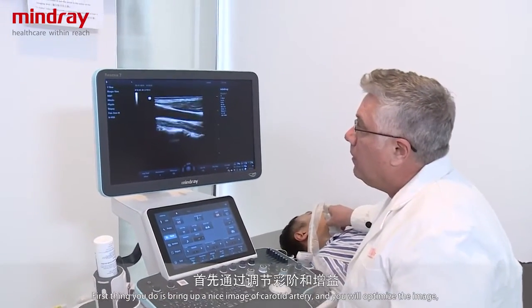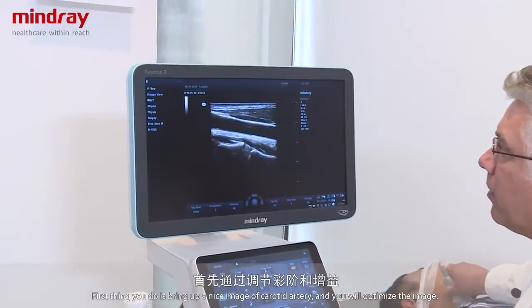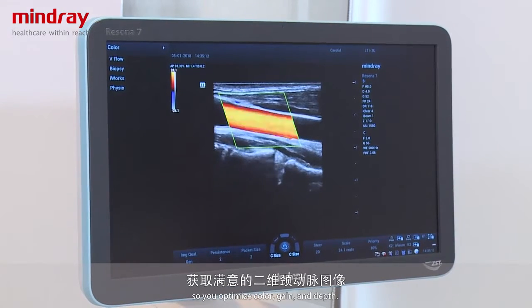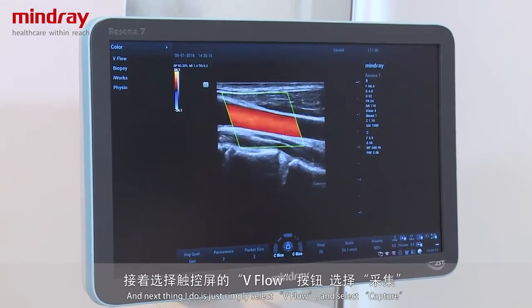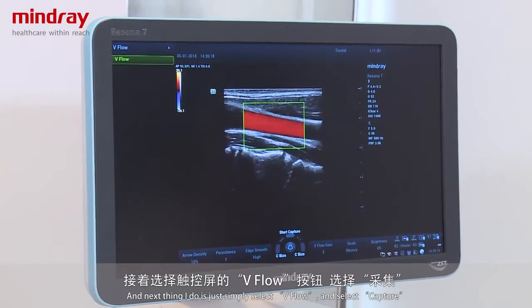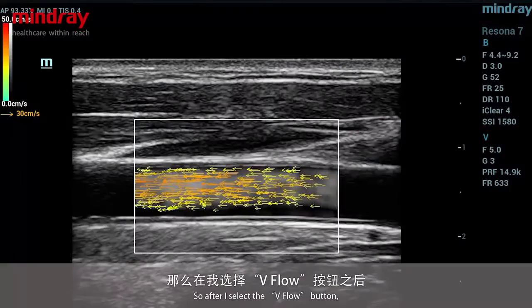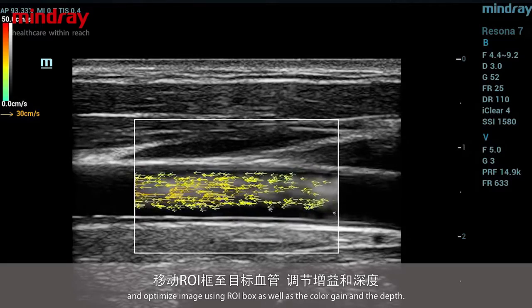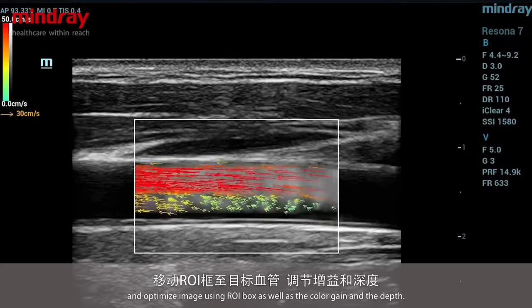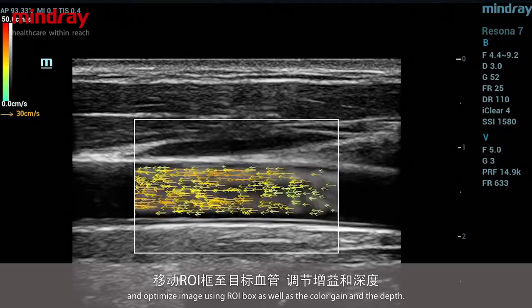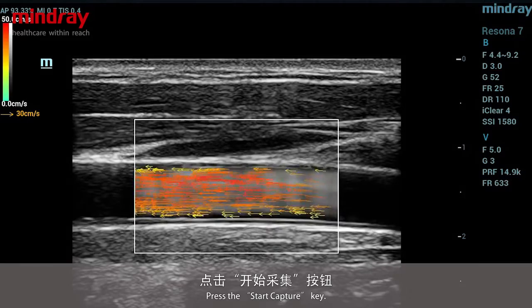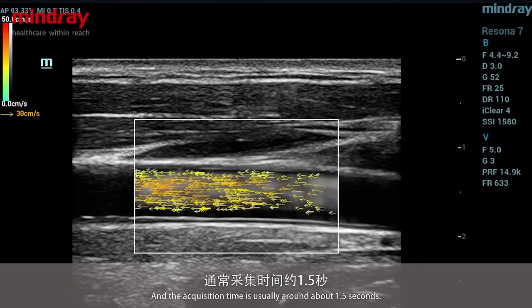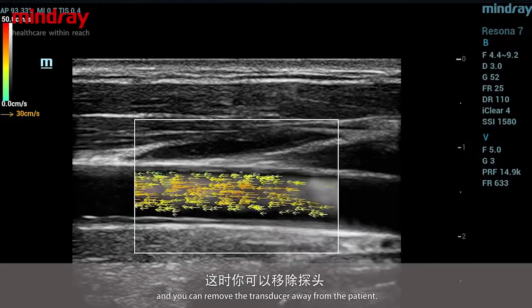First, bring up a nice image of the carotid artery, then optimize the image — your color, gains, and depth. The next thing to do is simply select V-flow and start capture. After selecting the V-flow button and optimizing the image using the region of interest box, color gain, and depth, press the start capture key. The acquisition time is usually around 1.5 seconds, and you can then remove the transducer away from the patient.